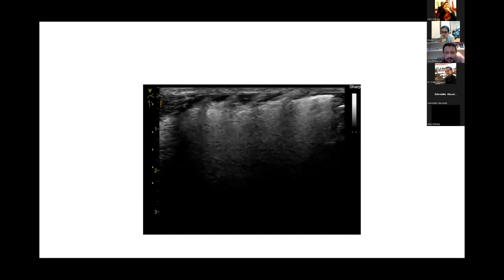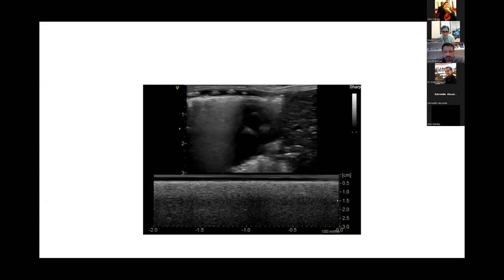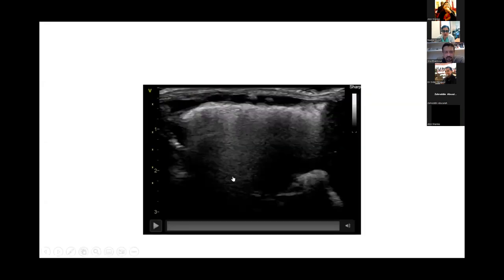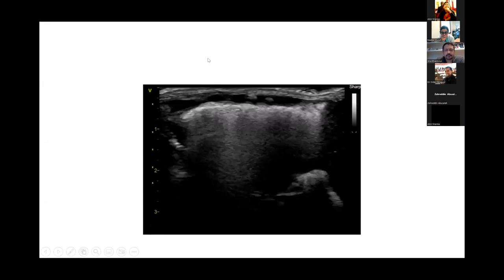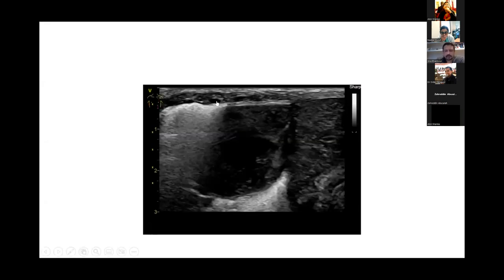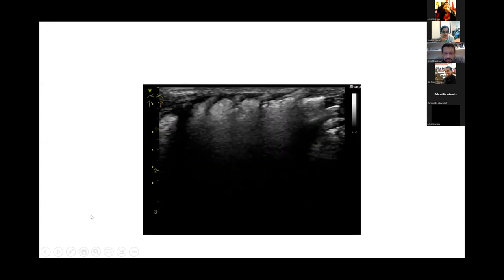Is this the scan you wanted to ask about, Suman? This one? I don't know. No, I mean, that was the last one on the left. Yeah, I think that must be the one. If the question is for me, I can't see any bronchograms at all, but... Oh, okay. Yeah, I got you. That was the last one on the left. Do we see any bronchograms?